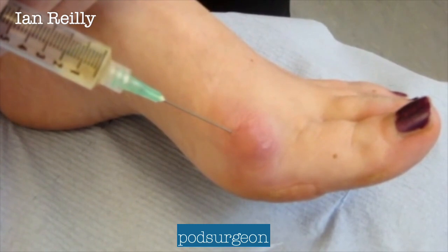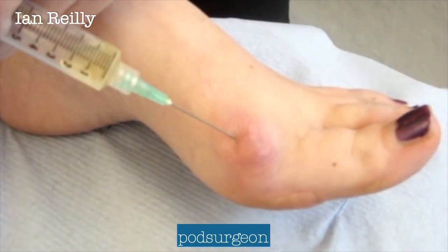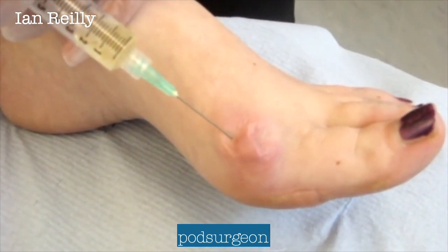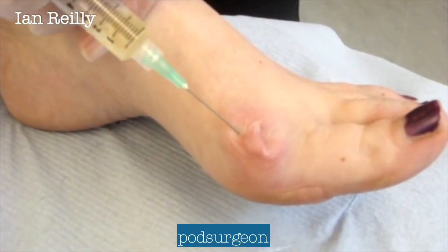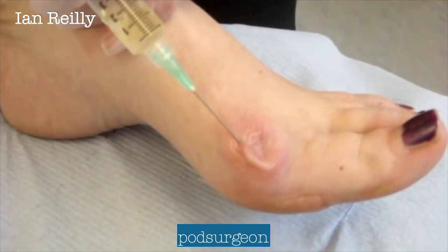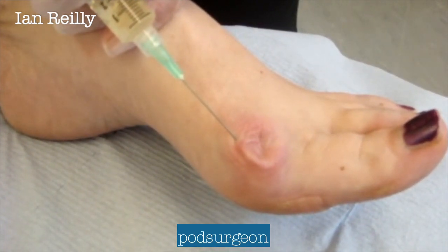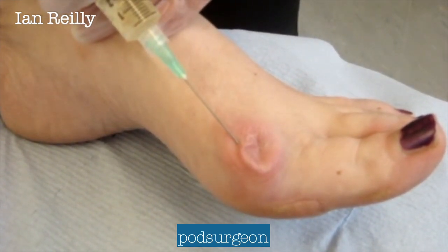The sound has been taken off this video because this clinic was next to a road with traffic in the background. My colleague is providing fairly steady and gentle suction on the needle to draw out the ganglionic fluid into the syringe — we're going to get about three to four mils in total. She's gently moving the needle around the sac with minimal patient discomfort. Once we think we've got all the solution out, we'll withdraw the needle. We used a second needle option to pop the vacuum but didn't need to in this case, making it quite a nice easy aspirate.